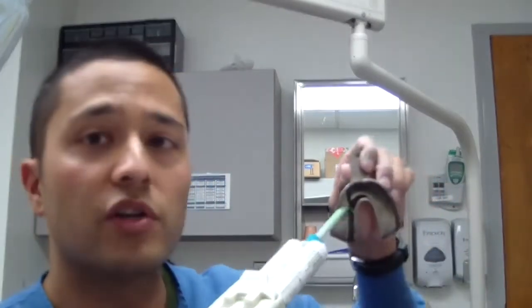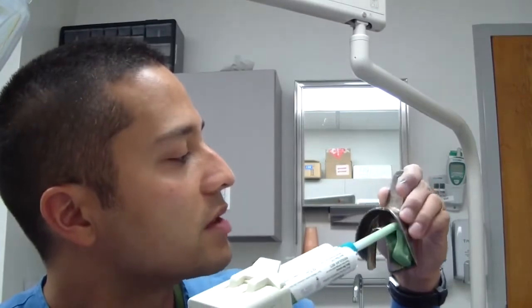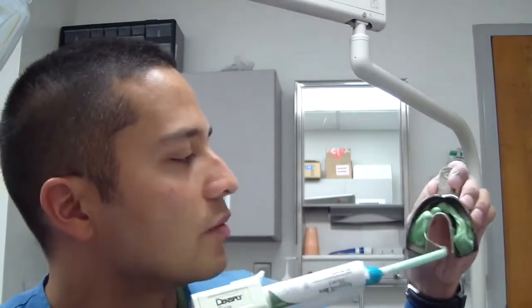Get them to start on the side that you're not doing the impression on. So if I'm doing an impression on this side, get them to start filling the tray over here, just to make sure that by the time they get over to this side and fill it all up, it's really mixed and there's no possibility of having improperly mixed polyvinyl siloxane — which means you may have to retake your impression. Just a couple of little hints passed on by one of my prosthodontic mentors. Hope it helps — ciao!